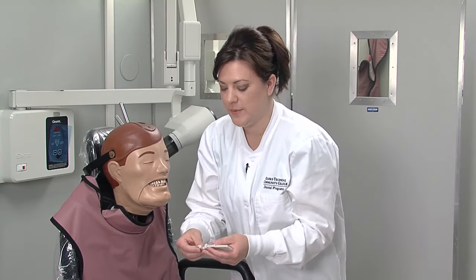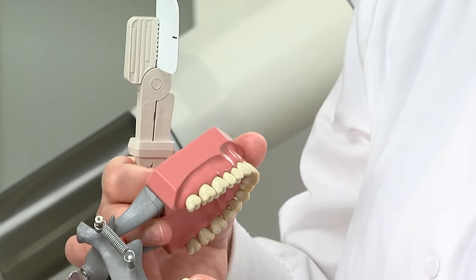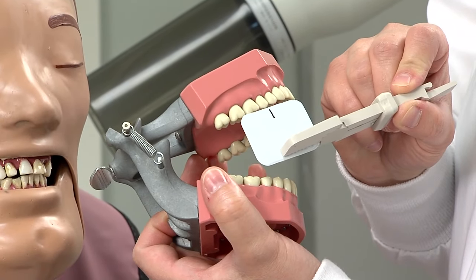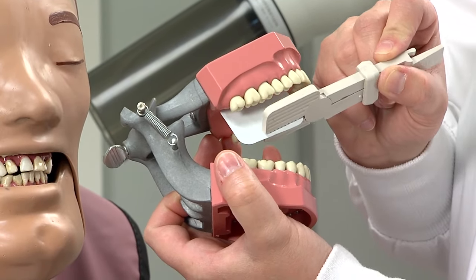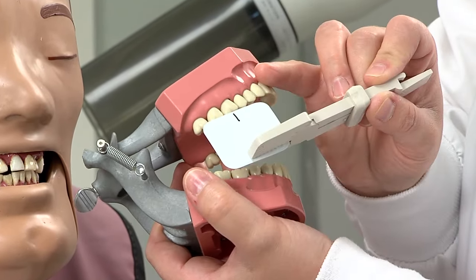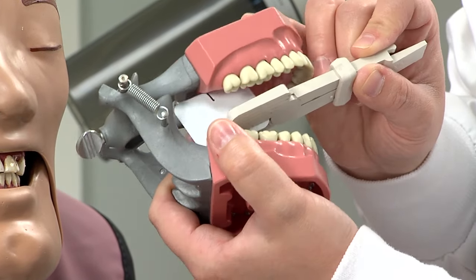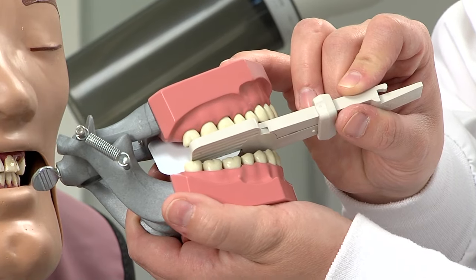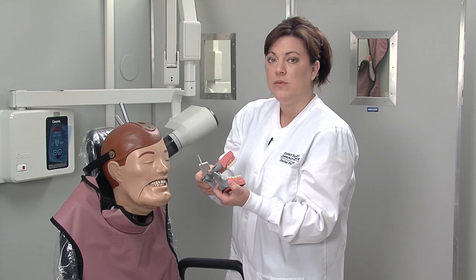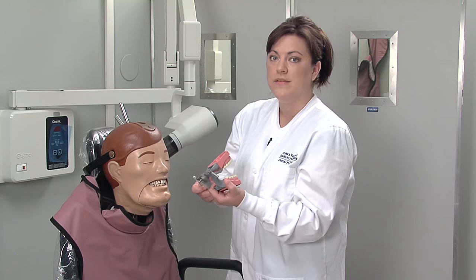For your posterior exposures on the maxillary, you would have your premolar and molar exposures. You would line up the center of the film on the second premolar and have the patient bite down. Then for the maxillary molar, you would line up the center of the film with the second molar and have the patient bite down. Remember, you cannot take bite wings with the snap array — you would have to utilize either a bite wing tab or a bite wing loop, as discussed in the previous video.